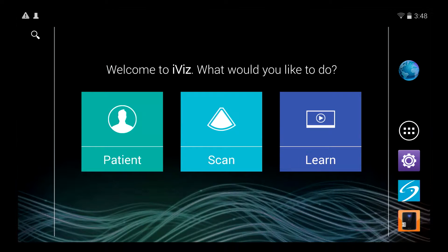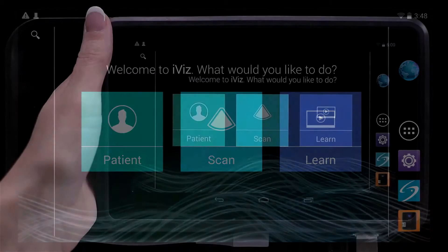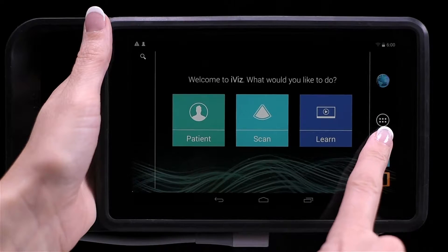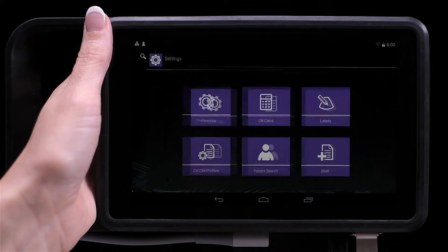Before taking your first clip, you want to make sure you've set the clip recording and clip length settings in the iViz preferences screen. Tap the iViz settings icon and then tap Preferences.